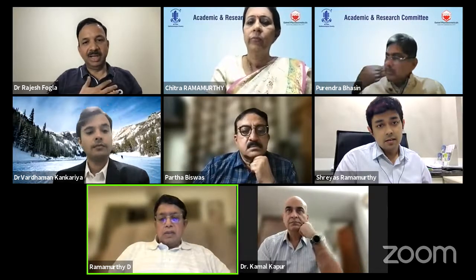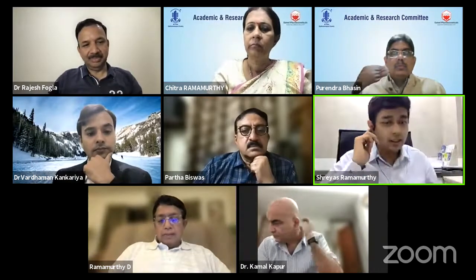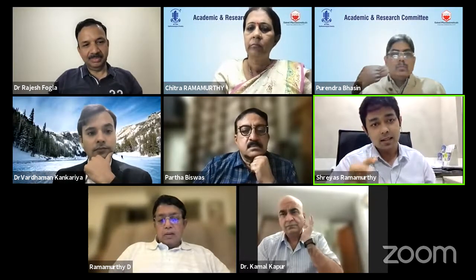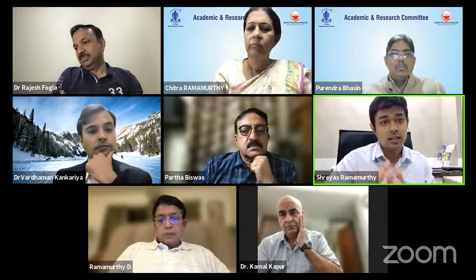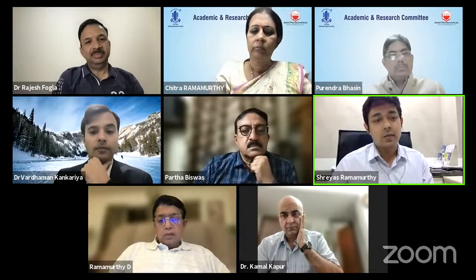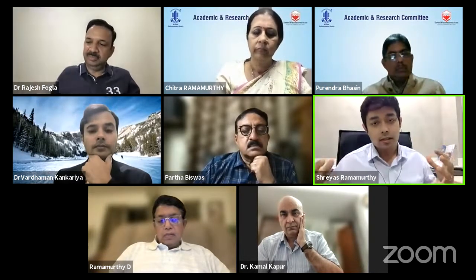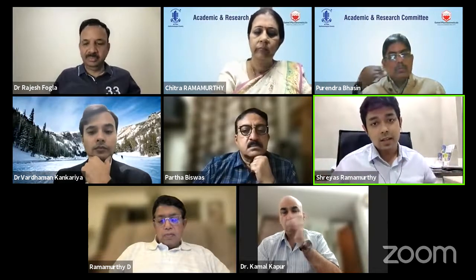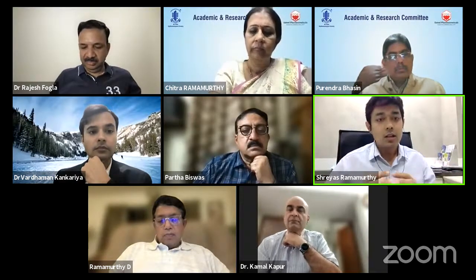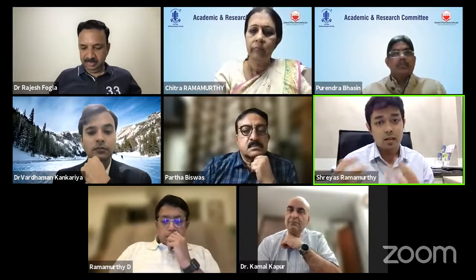I'm asking you, Suresh. No, sorry, it's not a multiplication factor alone. It's a regression equation. It has a constant and a variable component. Applying that regression equation to the large data set of about 600-700 measurements, we arrived at a linear regression analysis, which enhanced the accuracy, the agreement value and the R square.